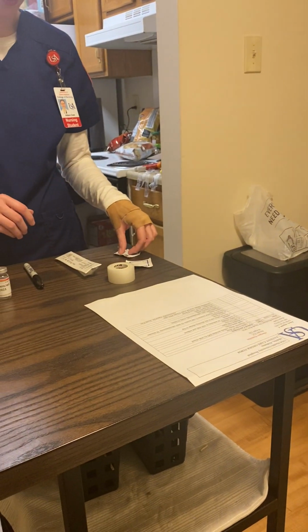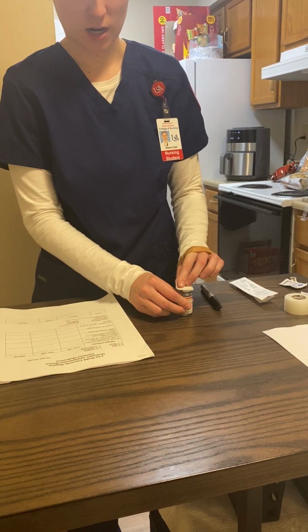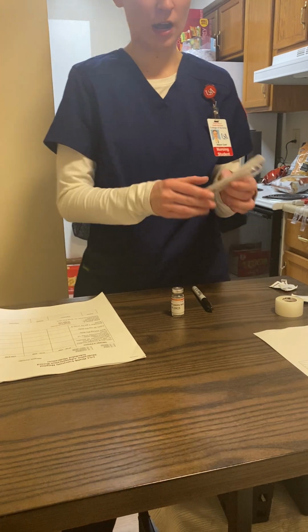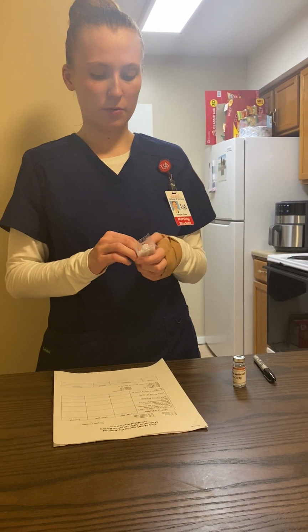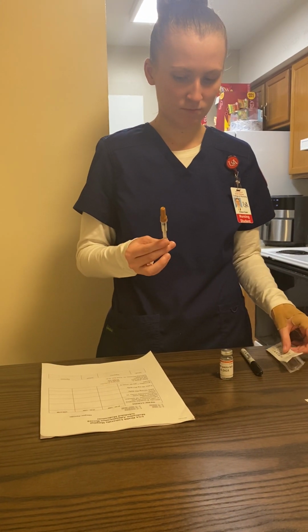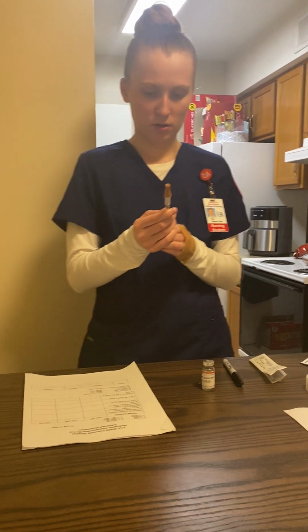Now I'm going to take a clean alcohol pad and clean off the top of the vial. Throw that away. Now we have our tuberculin safety syringe, which is 1 milliliter. Going to take that out. I'm going to insert some air.